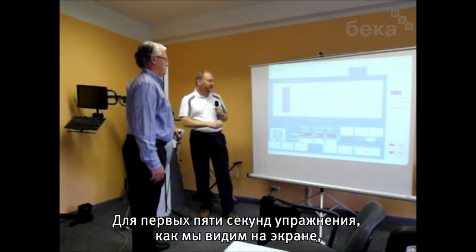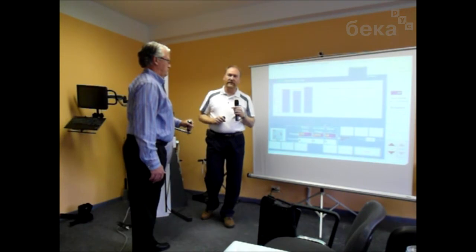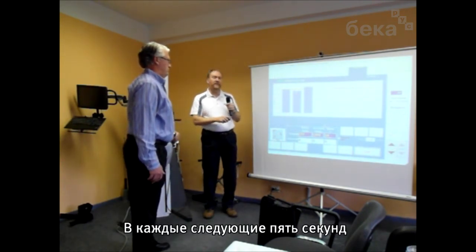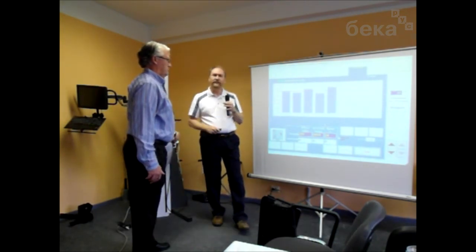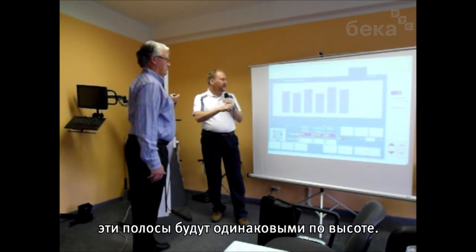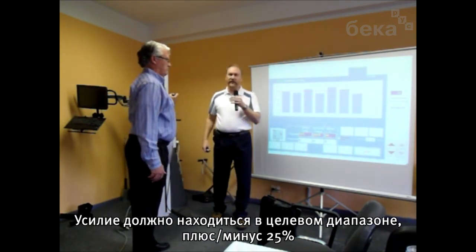So the first 5 seconds of the exercise, as we've seen in other screens, is always the 100% performance level. Every time an additional 5 seconds goes by, we compare how much work they did in that 5-second cycle and display that as a percentage. If the person is working consistently, these bars should be similar in height, at least within the target range of 100% plus or minus 25%.